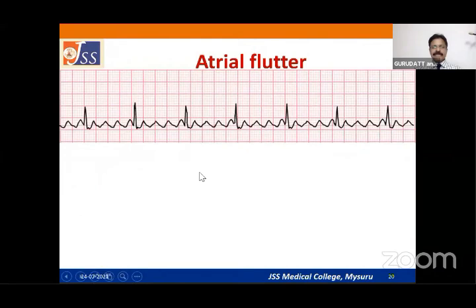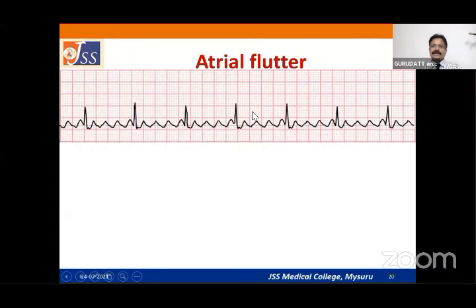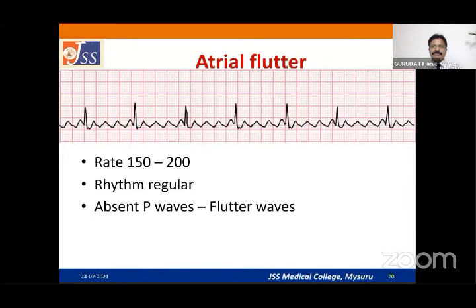Atrial flutter: instead of P waves, you see flutter waves — also written as capital F waves — with a sawtooth appearance. The rhythm can be regular, but if there is varying block across the AV node, it can be irregularly irregular. The causes and management of atrial flutter are the same as atrial fibrillation, and flutter can convert to fibrillation at any time.